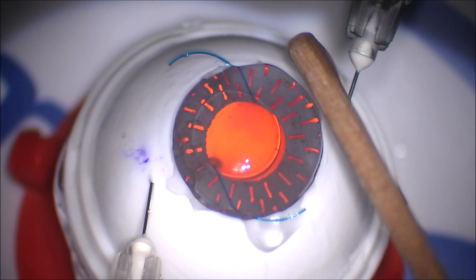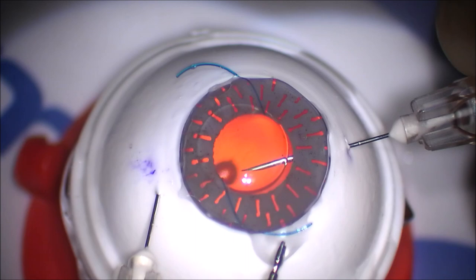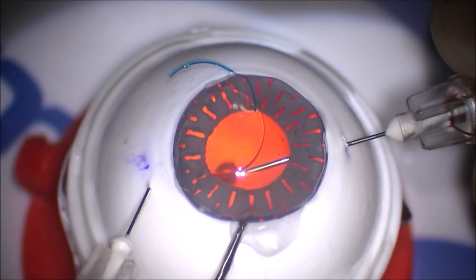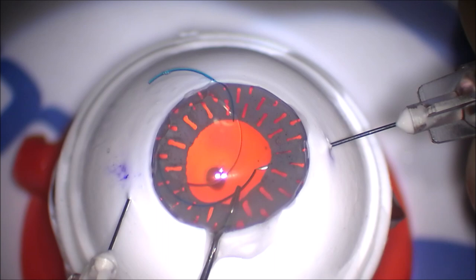So I go ahead and turn the right side needle. Again, the bevel is facing the approach of the haptic. I'm going in with my micro forceps very carefully, making sure I don't put too much tension on the haptic. Relaxing a little bit. And then I'm going to dock the haptic on the bevel of the needle, flattening it out, rotating my needle so it goes in straighter towards the haptic. You can see it cannulated quite nicely.